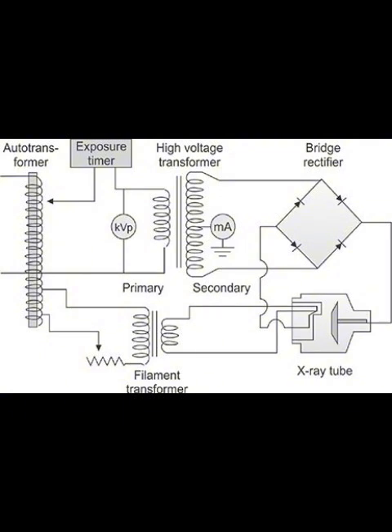So with a 60 hertz supply, like in the US, you actually get 2 pulses per cycle. That means 120 pulses every second. A rapid firing of electron bursts. A very rapid series, yes. And more pulses generally mean more efficient X-ray production. Got it. Now, voltage ripple, that sounds undesirable.